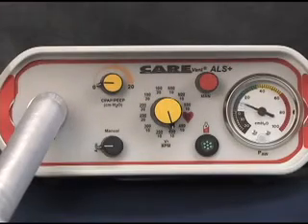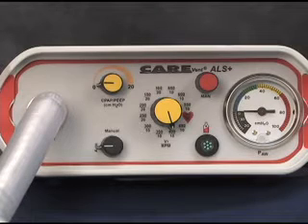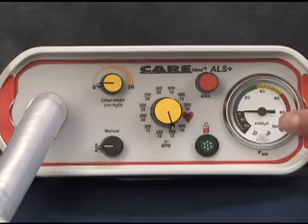The CareVent ALS Plus or ALS Plus CPAP ventilators have an airway pressure gauge to allow the rescuer to monitor the ventilations and the patient's condition.